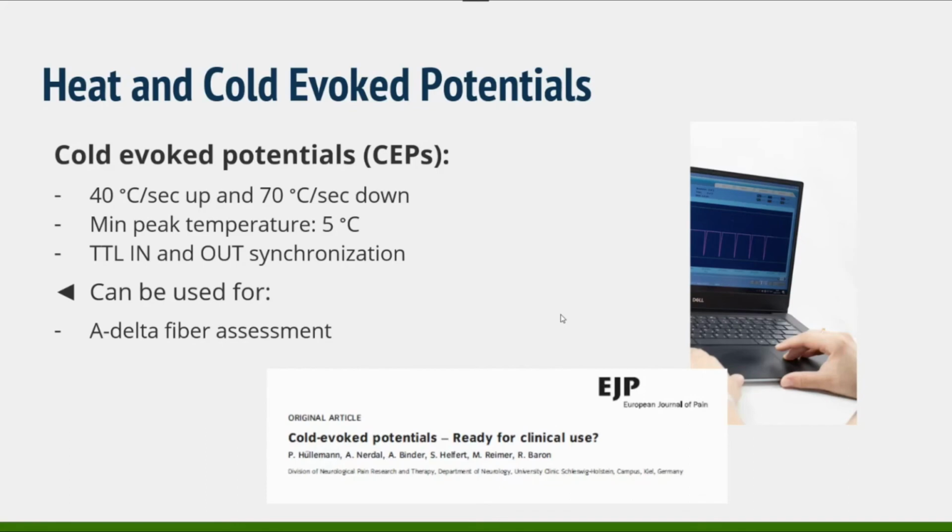They used this going to 20 degrees with our previous pathway CHEPS device, and even with going to 20 degrees, they were able to record cold evoked potential, with not very large amplitude, in healthy volunteers, of course. And then when they applied the block on A delta fibers, they demonstrated that there was absent evoked potential. So they proved in a way that the evoked potential was related to A delta fibers and its functionality.